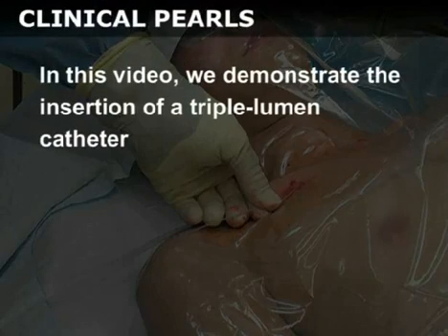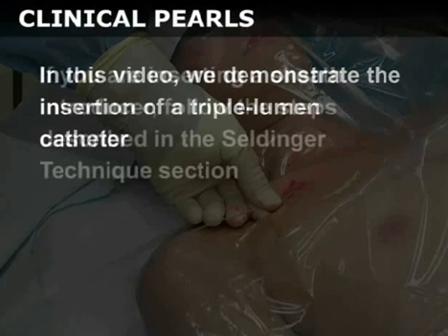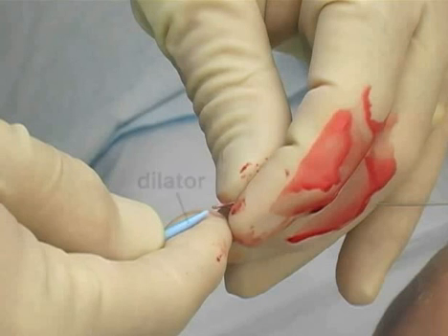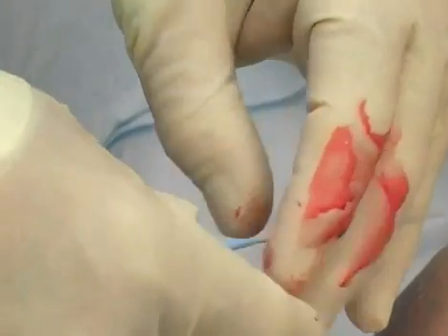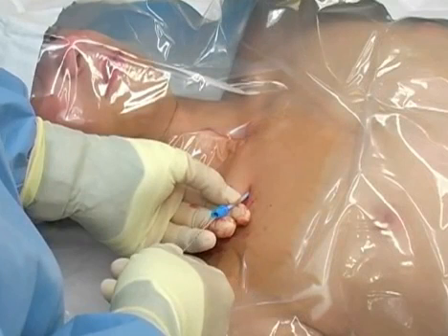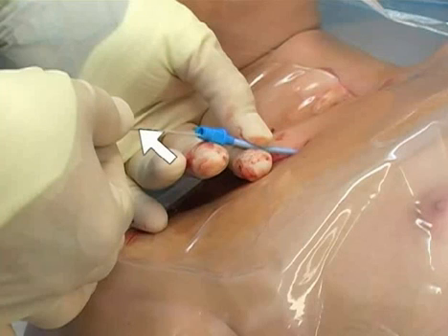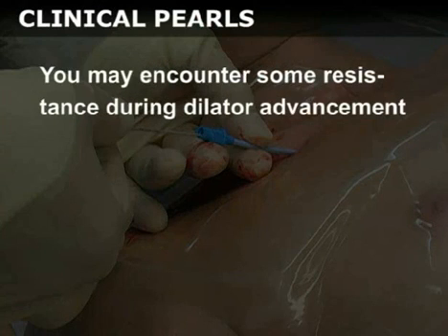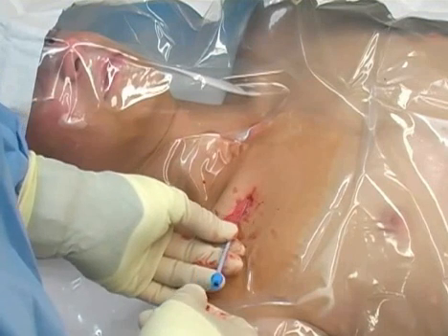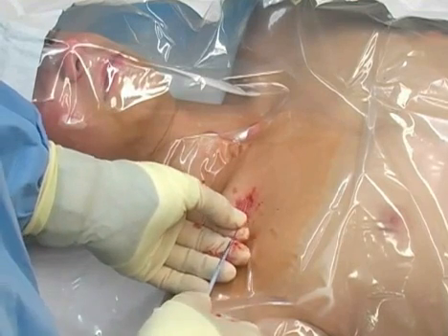In this video, we demonstrate the insertion of a triple lumen catheter. If you are inserting a sheath introducer, follow the steps described in the Seldinger technique section. Hold the very tips of the dilator and the guide wire to steady them, and advance the dilator over the wire. Advance the dilator through the skin and into the vessel. Make sure that you always have a firm grip on the wire at all times. You may encounter some resistance during dilator advancement; a slight rotating motion may be helpful. You may now remove the dilator, leaving the guide wire in the vessel.